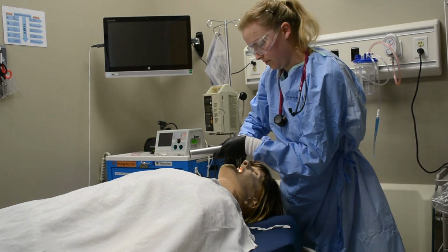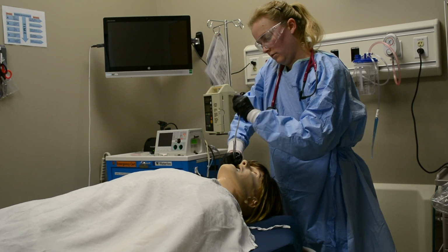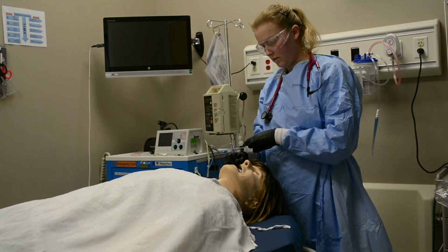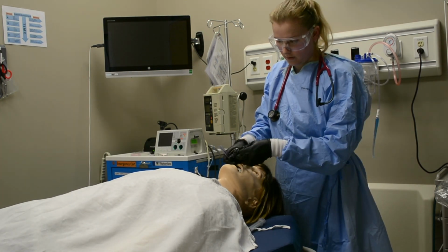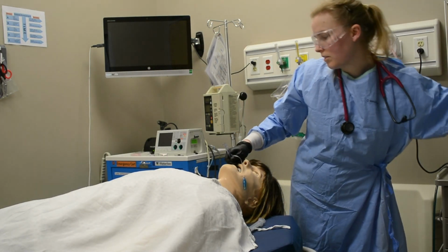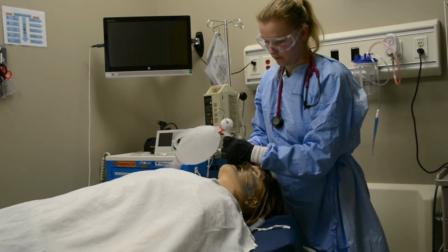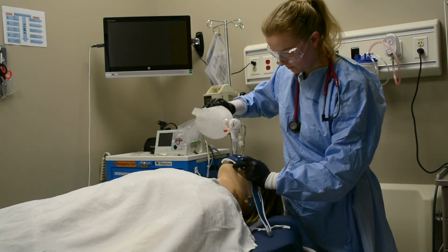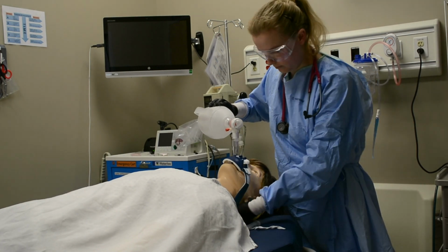Carefully remove the laryngoscope. Remove the stylet and inflate the cuff. Attach the bag to ventilate. Secure tube with strap after confirmation of placement.